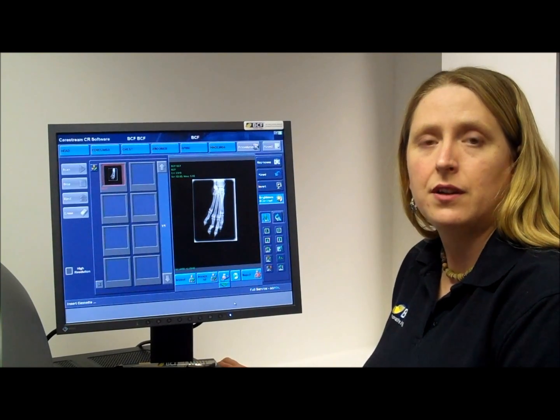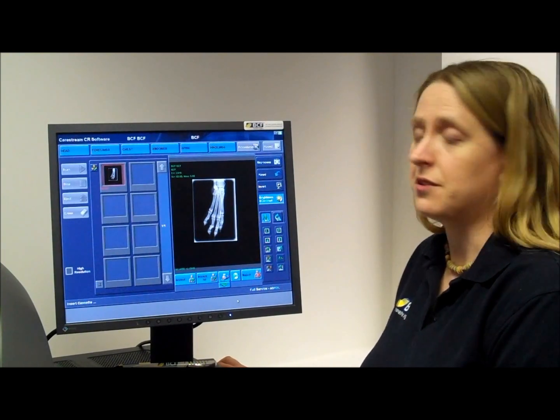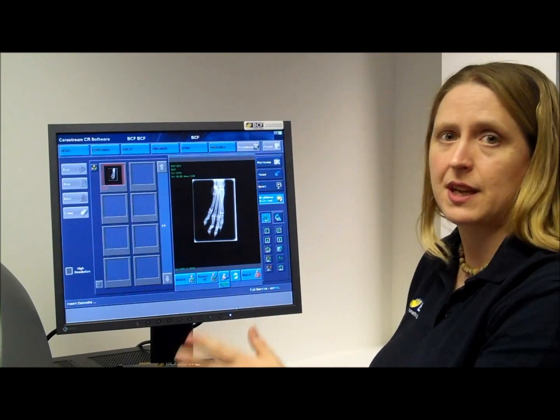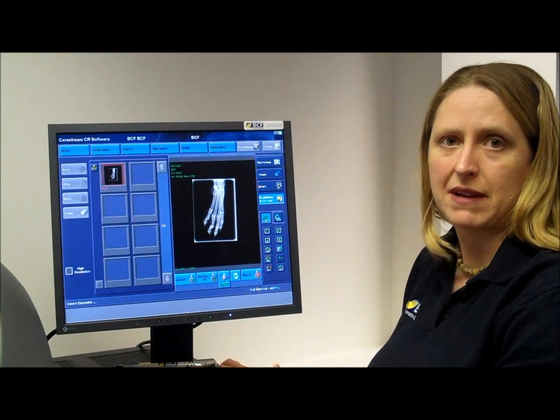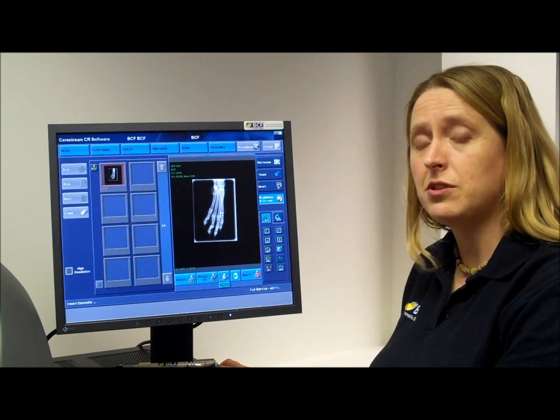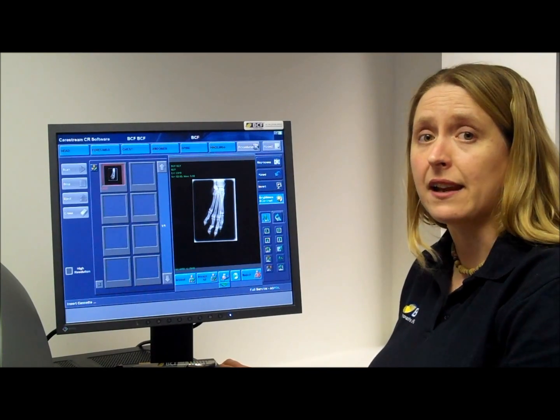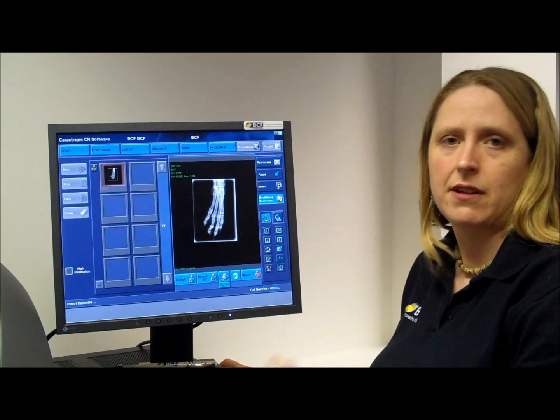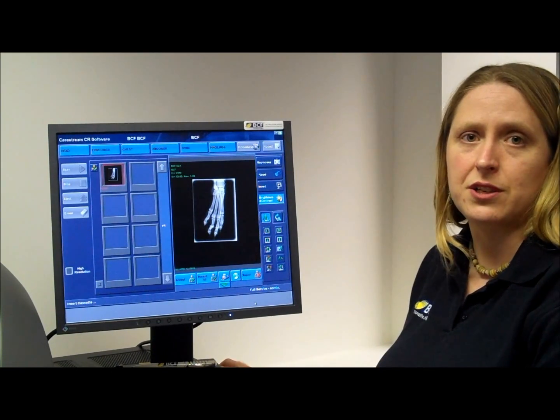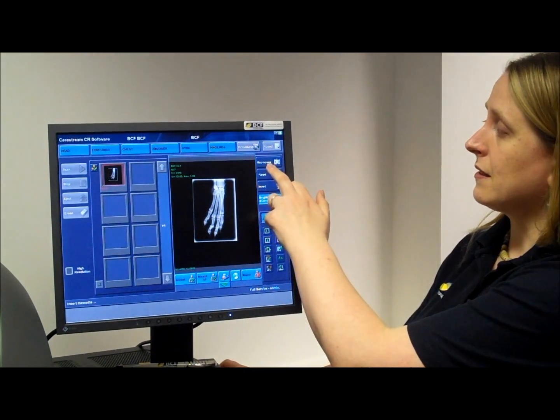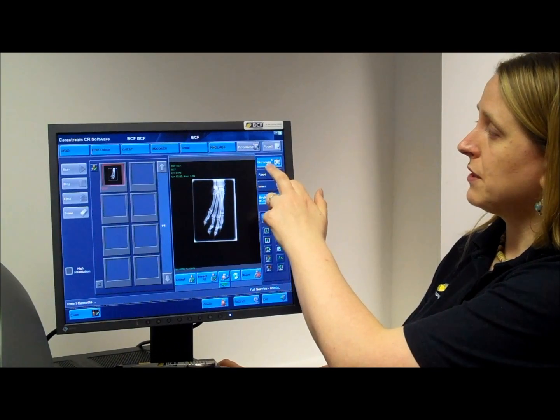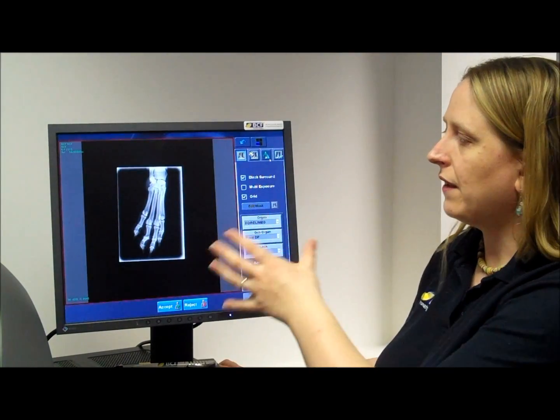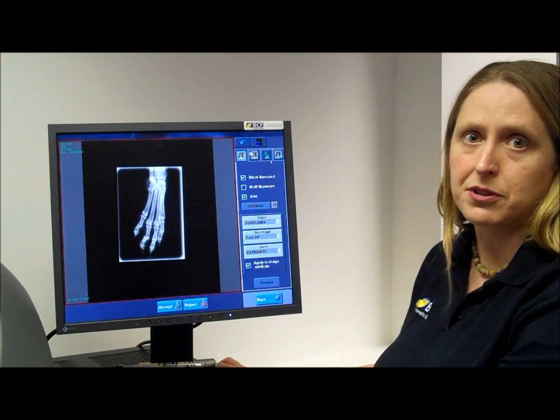Once you've taken your picture, you have two options. If you're happy with the picture as is, you can just hit accept — that saves the picture as it is — and later on, if you want to, you can always go back and reprocess it again. Alternatively, if the picture's incorrectly orientated or you want to make some changes, all you do is click onto reprocess, give the machine a moment to move into the next page, and then you're ready to reprocess your image.